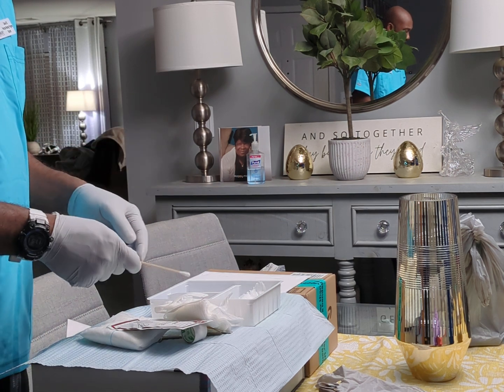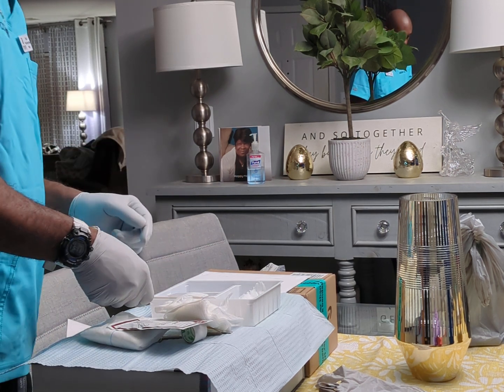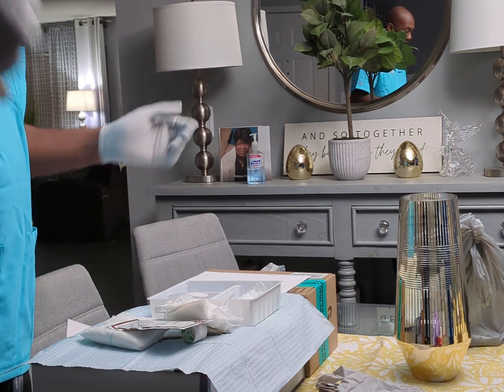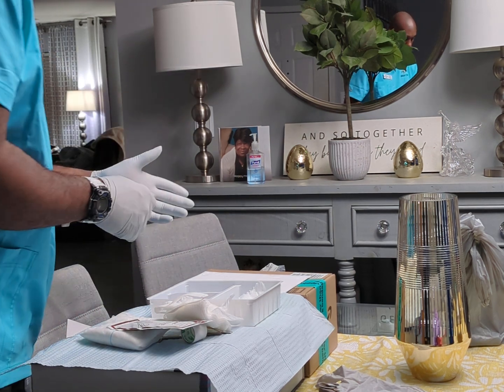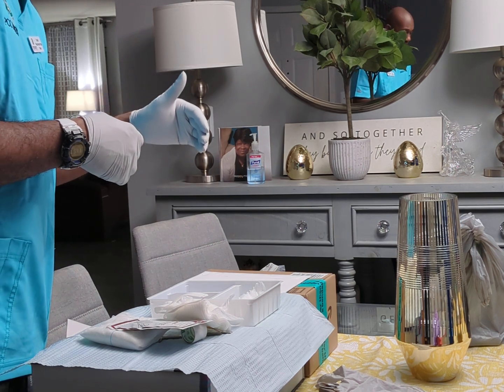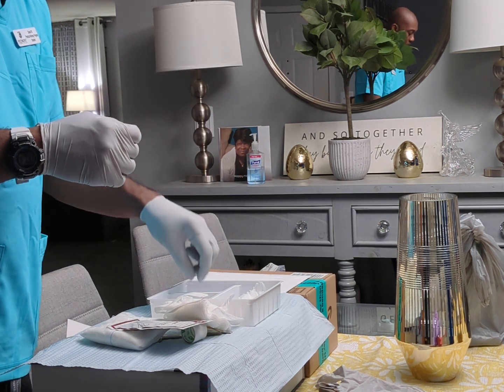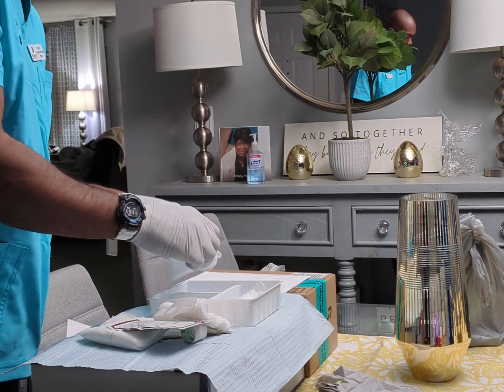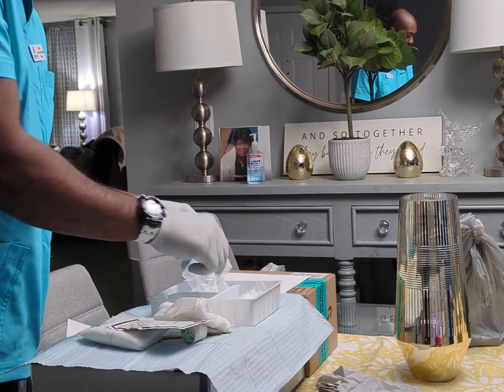Okay, now, just while I'm doing it, I'm keeping my eyes open, just inspecting my wound. Like I said, I tossed that away. I don't want to throw it in the trash right now. And then now I'm gonna go ahead and clean my wound. Now I have my gauze. Okay, make sure my gauze is wet.